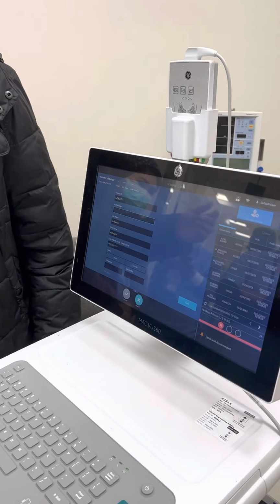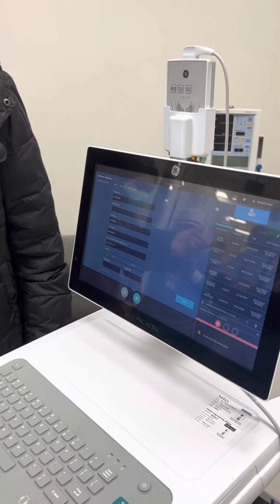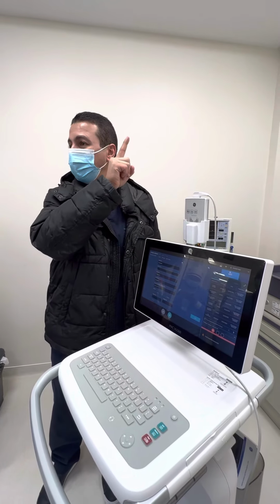It will help you to attach every single piece of information about your patient. It will help you to get the right interpretation. Then to do the transmit, it will be in the patient's profile directly. So it will just pass the Muse and go to the patient's profile.